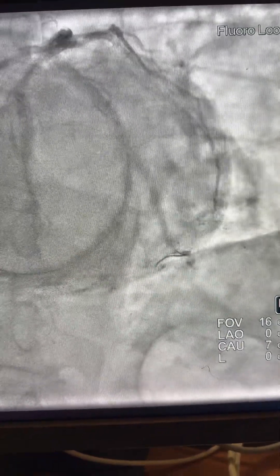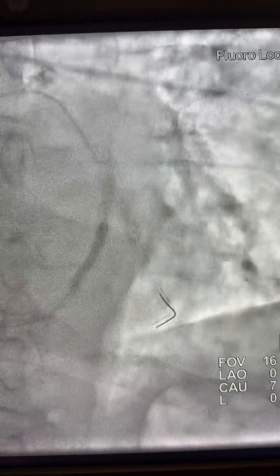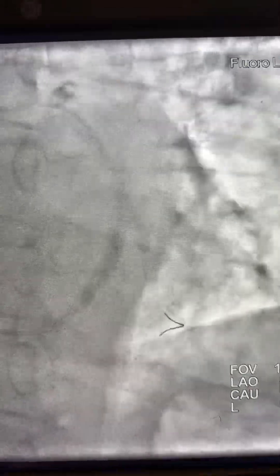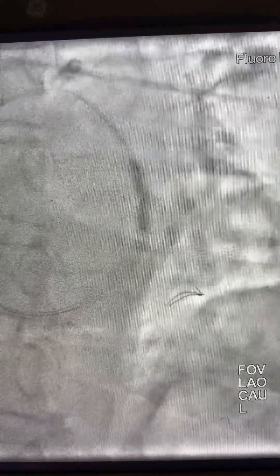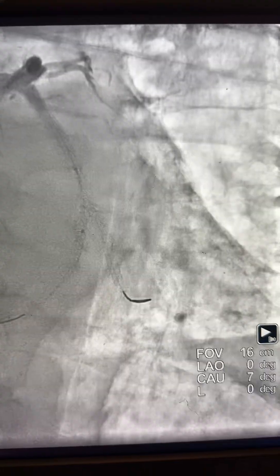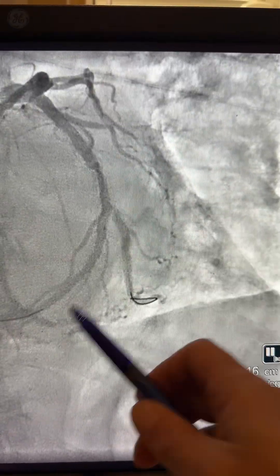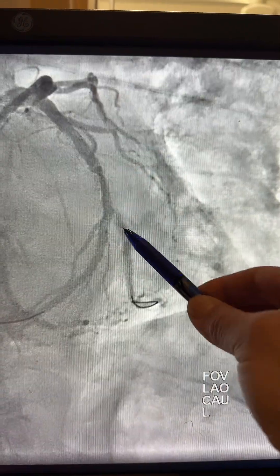Here is the first stent — it was deployed. Then we advanced the balloon to the circumflex, overlapping with the prior stent, and inflated at higher pressure. Then we inflated the ostium at high pressure. Here is the result toward the distal circumflex toward the PDA — the PL is happy. Now we have this compromise, which is the ostium of the OM, which is a large vessel.